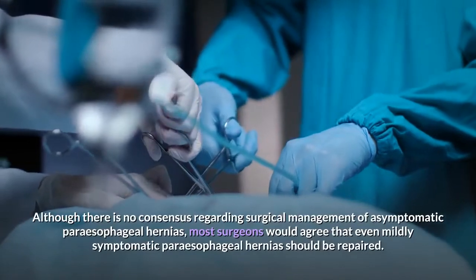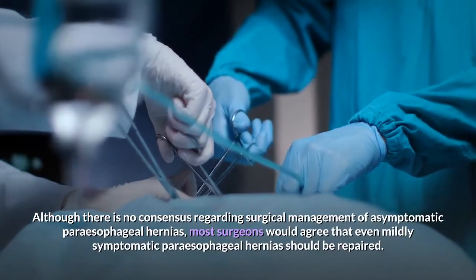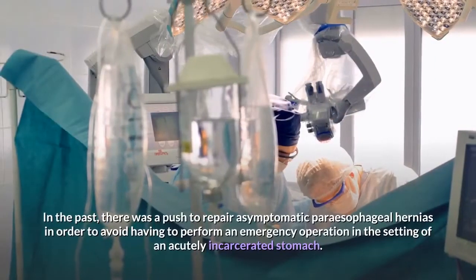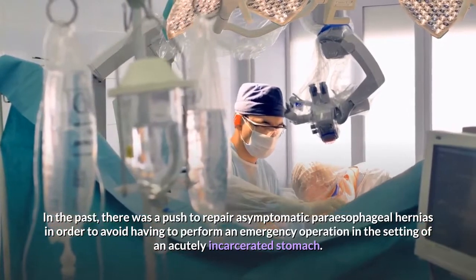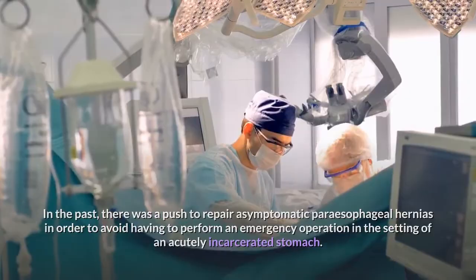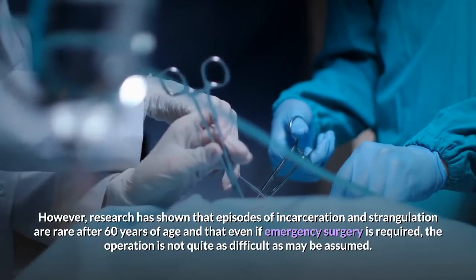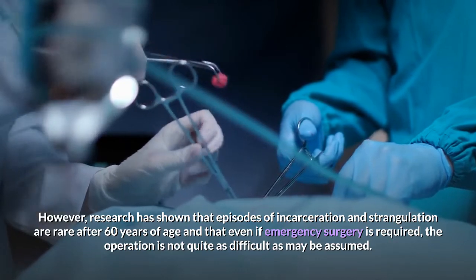Although there is no consensus regarding surgical management of asymptomatic paraesophageal hernias, most surgeons would agree that even mildly symptomatic paraesophageal hernias should be repaired. In the past, there was a push to repair asymptomatic paraesophageal hernias in order to avoid having to perform an emergency operation in the setting of an acutely incarcerated stomach. However, research has shown that episodes of incarceration and strangulation are rare after 60 years of age and that even if emergency surgery is required, the operation is not quite as difficult as may be assumed.